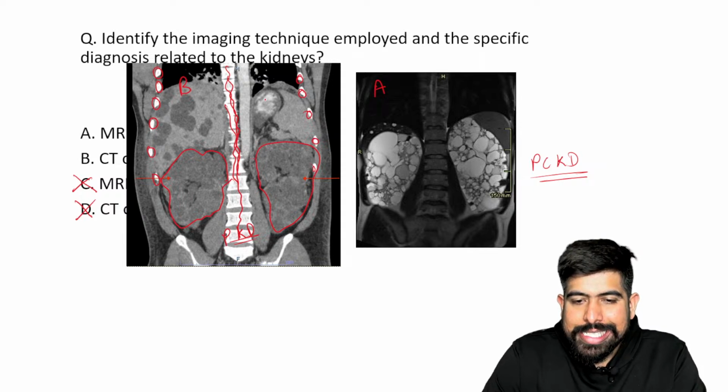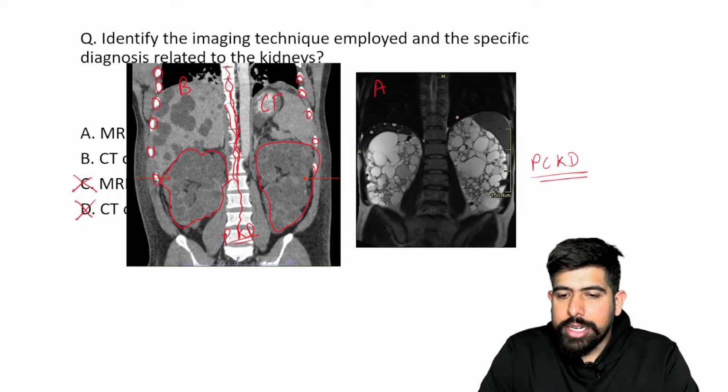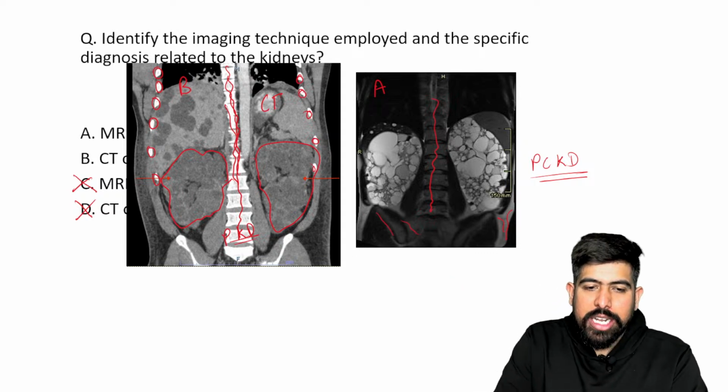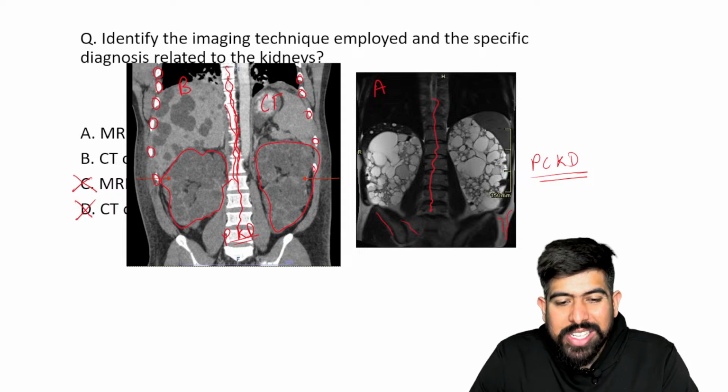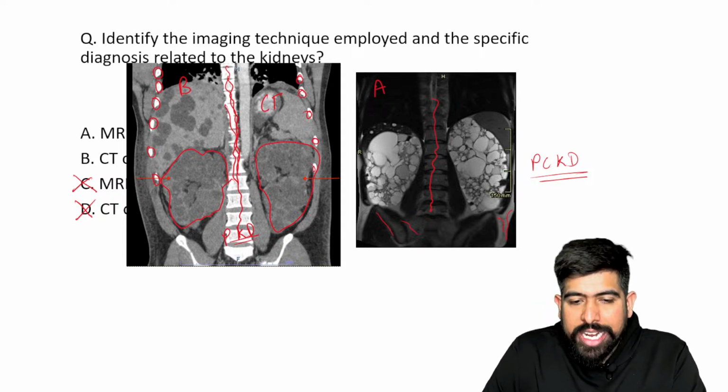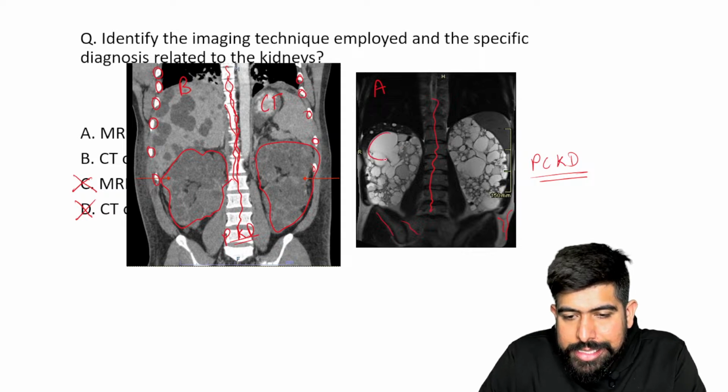So this is your CT scan, and over here, this is the vertebrae, and these bones are not seen white. Can you identify now? This is not seen white on the MRI. So on the MRI, what I can see is the cyst.